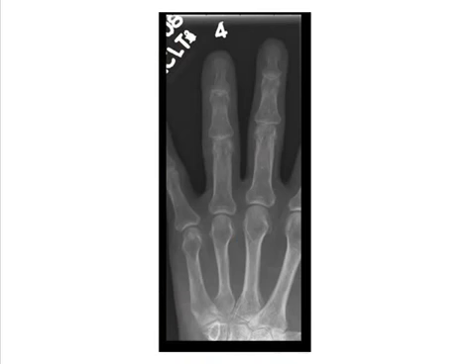A PA digit radiograph should demonstrate all skeletal anatomy from the fingertip to the distal portion of the adjoining metacarpal. Equal concavity of the phalangeal shaft, surrounding soft tissue, and fingernail should be well visualized.